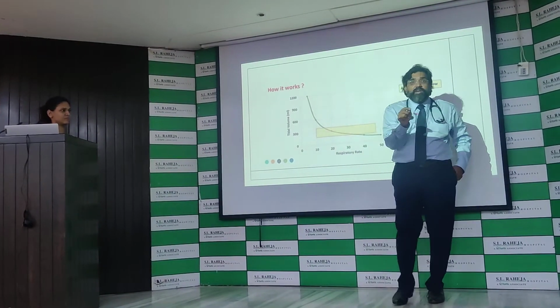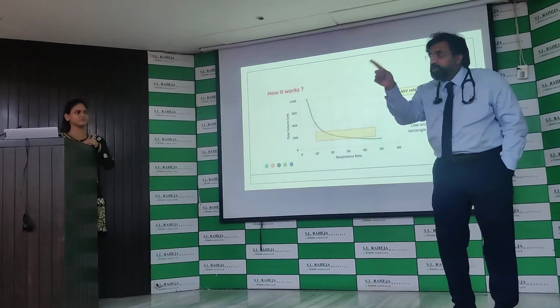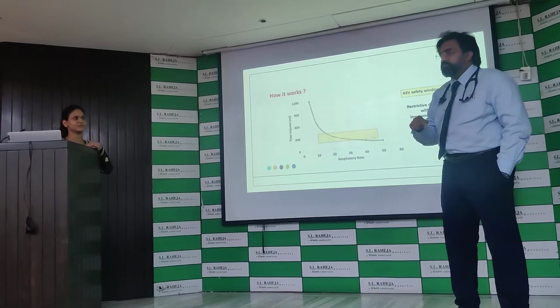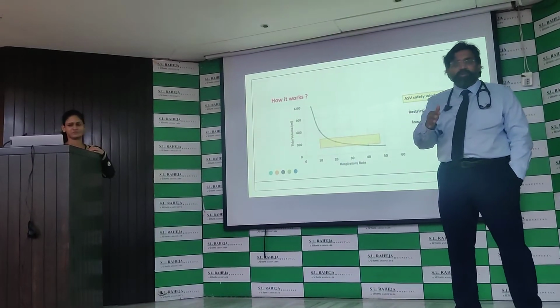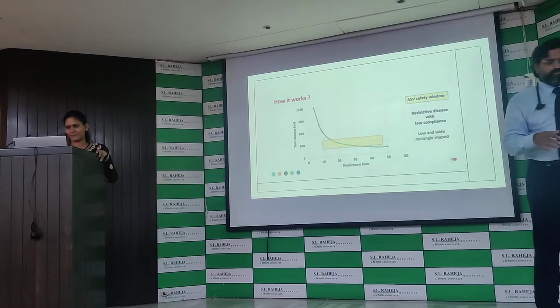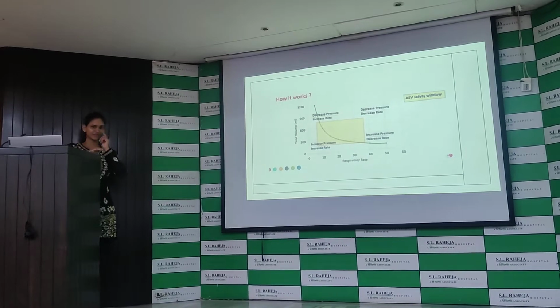So at any given moment, if you switch on the ventilator that is working there and you press tidal volume, you will not see it going more than 6 ml per kilogram. You have to do everything possible to keep it less than 6 ml per kilogram. You understood this? This is how it works.